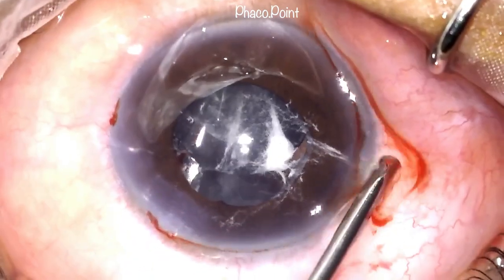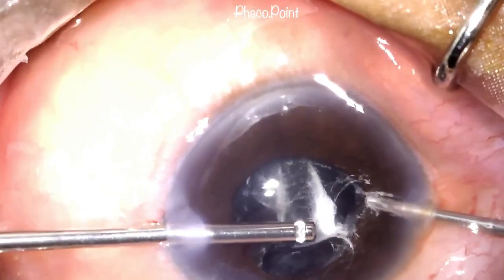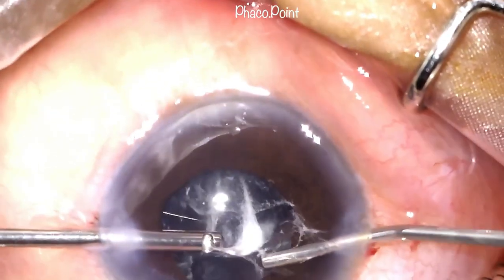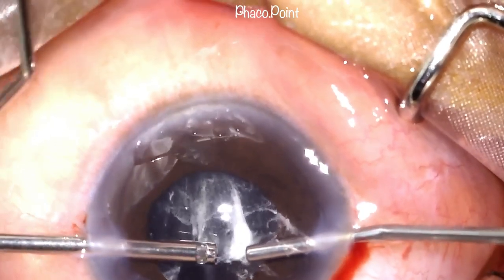You might notice how more and more vitreous seems to be prolapsing into the anterior chamber. It's important to ensure that we clear all the vitreous from the anterior chamber.